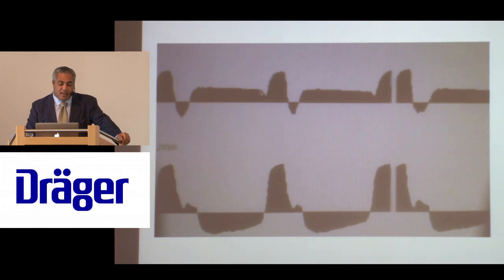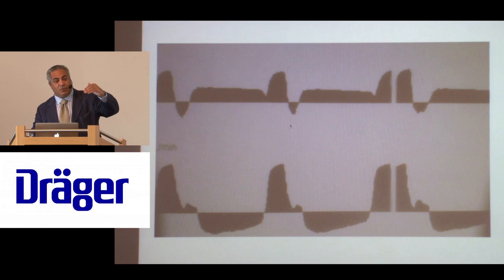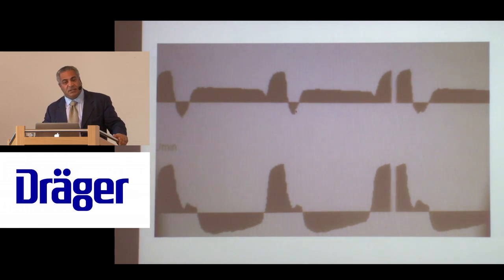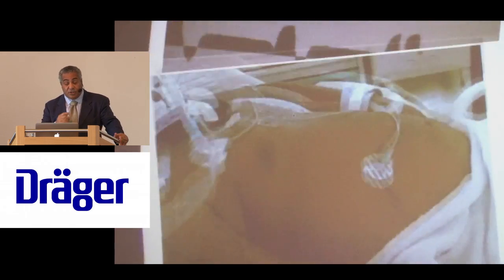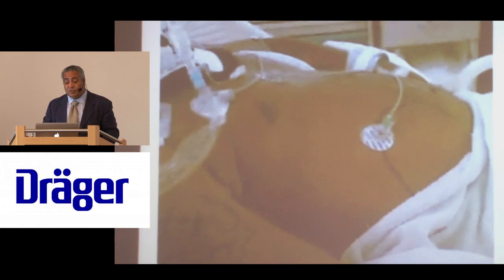So the patient's making an effort, pulling the PEEP level down, pulling throughout this breath, essentially rounding the airway pressure profile, and you can see just a massive amount of effort. So in my view, this is not good spontaneous breathing, because this is going to have high effort and high transpulmonary pressure, very likely. I'll just show you a patient here. This is on low tidal volume strategy.